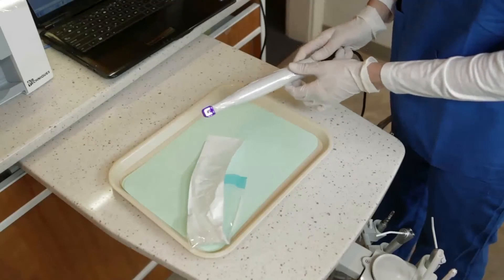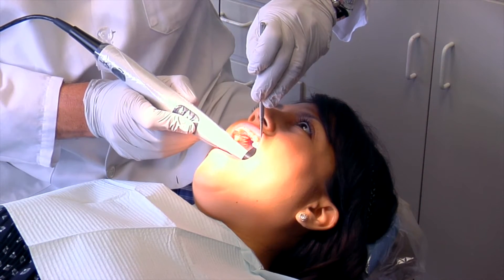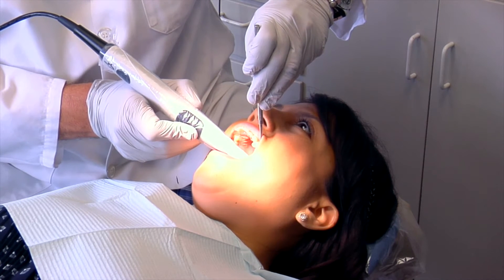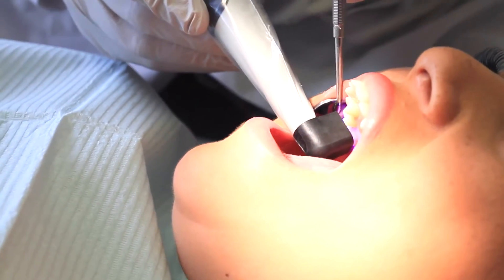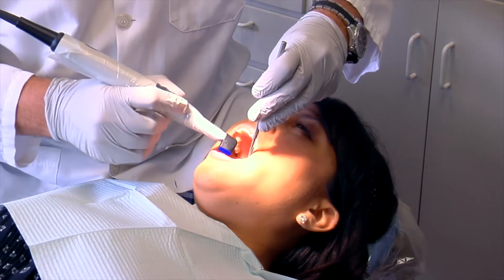After the hygienist goes in and polishes the teeth, she typically takes the camera and scans each tooth to look for decay and to show the patient where the decay is in their mouth. Then we place the camera and scan the tooth — it's very easy to go around the entire mouth and do very quickly.